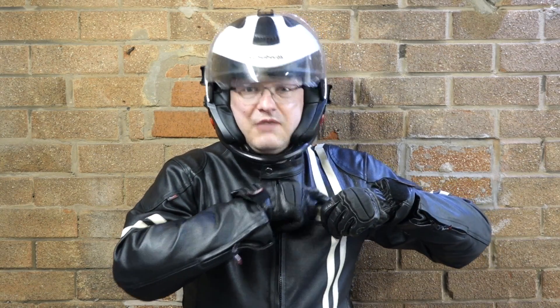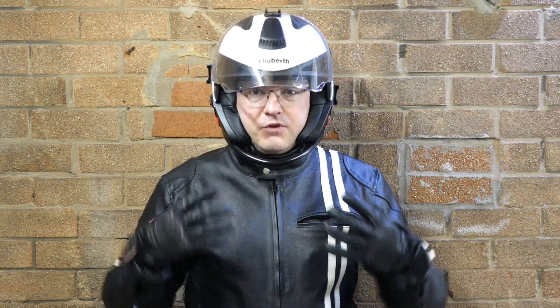You might think I'm wearing a shirt so the sensor can reach the machine, but it's not necessarily the case — it can go through some very thick clothing, including my motorcycle jacket. And notice I've got my gloves on here, which you'd normally need to take off to test your blood, but through my jacket I could get a reading. It's a good job I did that the other day — I was just about to set out on the bike and I wasn't sure if I was warm because of my gear or because my blood sugar was low. I tested it through my jacket and it said I was at four, which meant I had to take everything off, have something to eat, and wait 45 minutes before going out — but at least I found out. The worst thing would have been setting out and having a funny turn down the road.